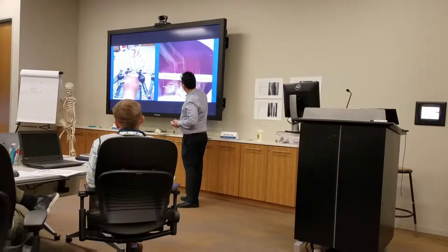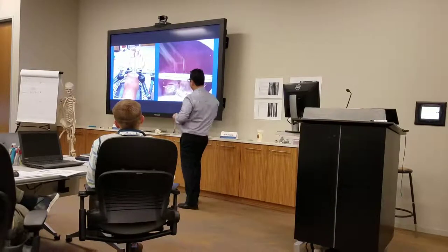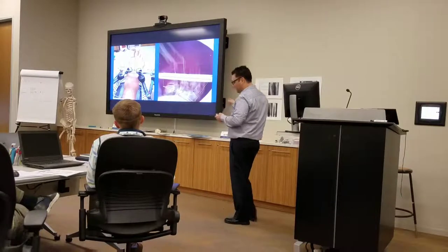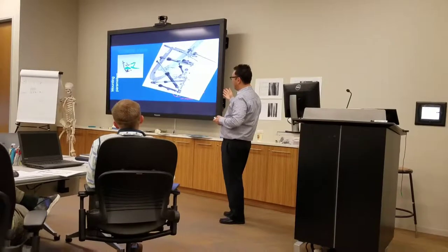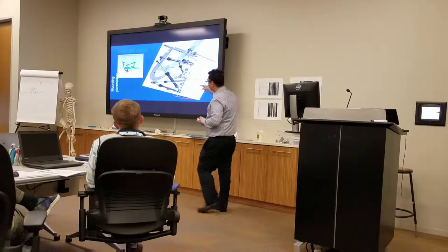You see how much translation you have. This is the center of the ring, so you can measure your translation when you're putting in your mounting parameters. Here's how you should look at it in the lateral view. You're going to have the center of the ring.